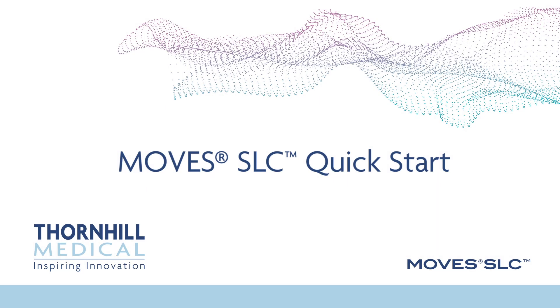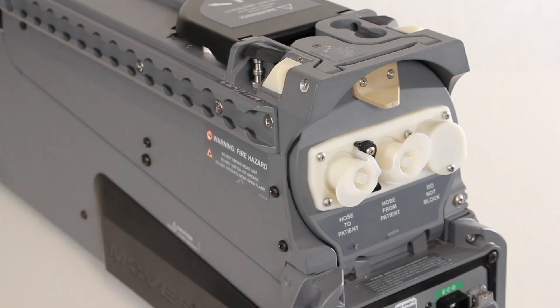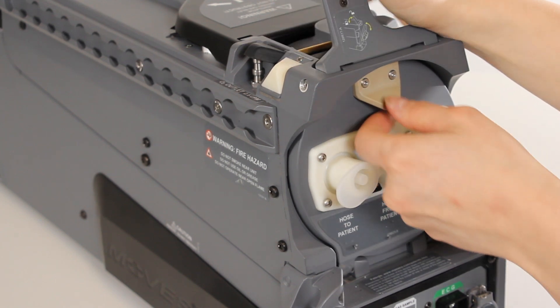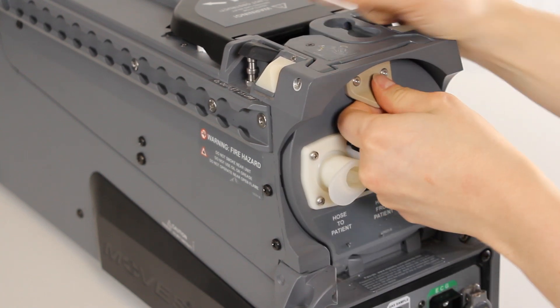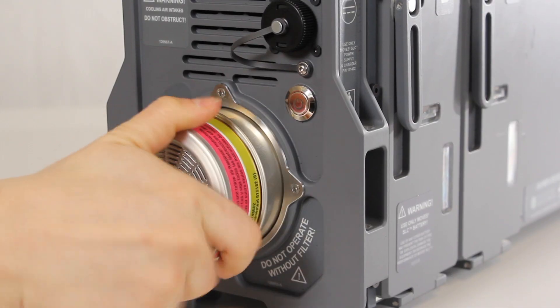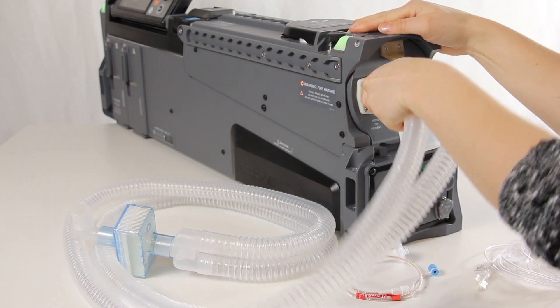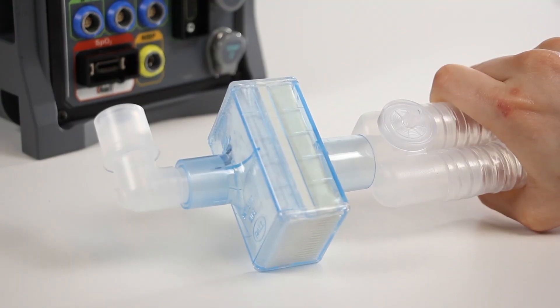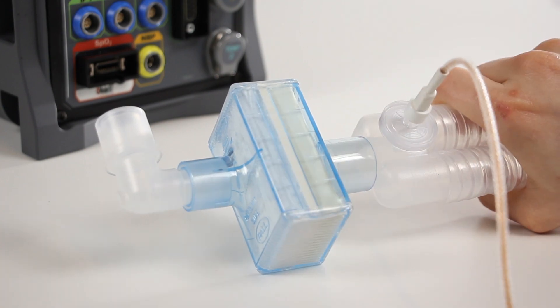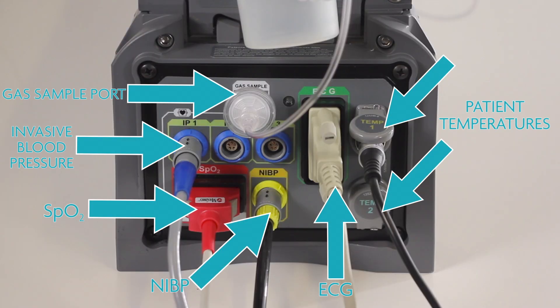MOVES SLC Quick Start. Lift the release latch for the ventilator cartridge door at the top front of the MOVES SLC. Insert the ventilator cartridge, close the door and lock it by depressing the latch. Install the hydrocarbon filter in the rear panel. Attach the appropriate breathing circuit to the cartridge door. Connect one end of the Nafion tubing to the sampling line, then connect the other end to the Y-piece. Connect the sampling line to the gas sample port. Connect the patient monitoring accessories to the MOVES SLC. Do not connect to the patient at this time.